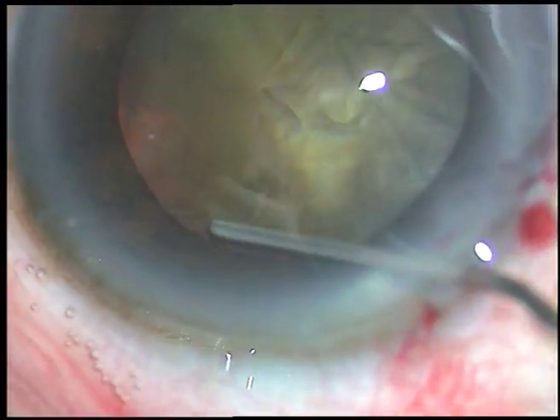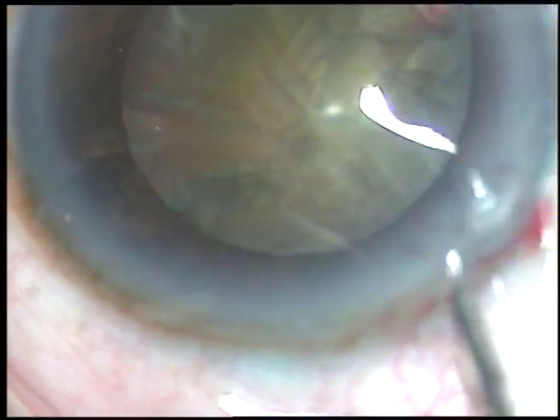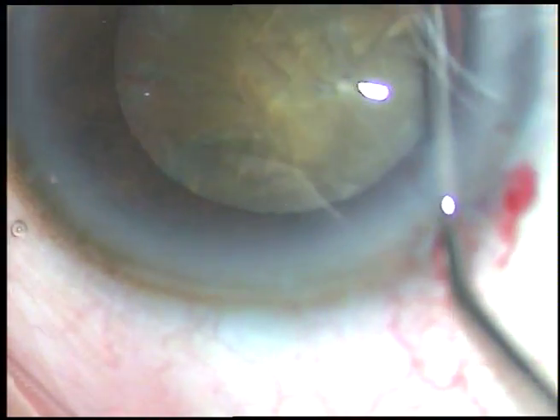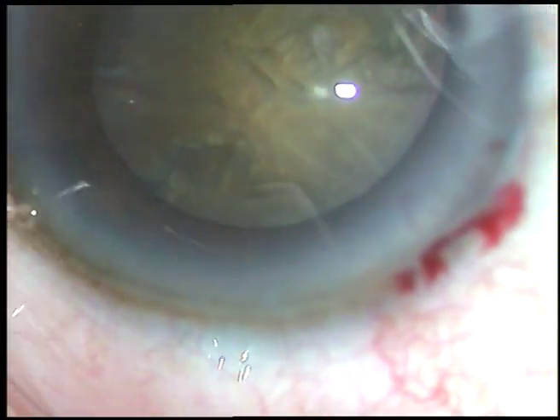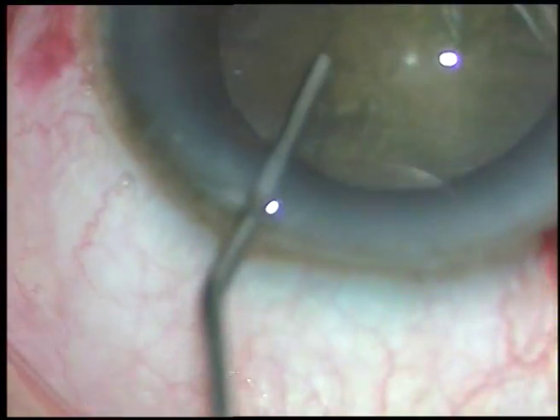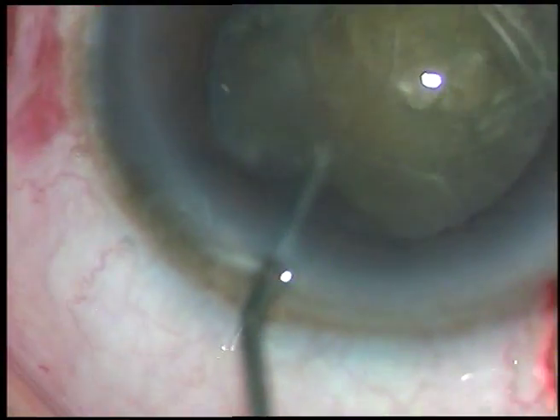Now this is hydrodissection. Fluid wave is passed underneath the anterior capsular rim. The nucleus is tapped. Hydrodissection is being done at multiple points and now the nucleus is rotated.